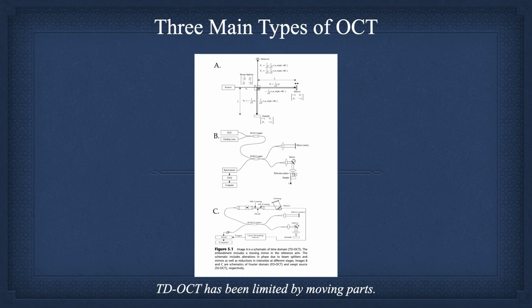Now these are drawings of schematics of the 3 OCT systems. I'm not going into them. Time domain, for what we're concerned about, is the only one with moving parts. The reference arm changes. There's a mirror, and we assume there's a mirror in the reference arm.